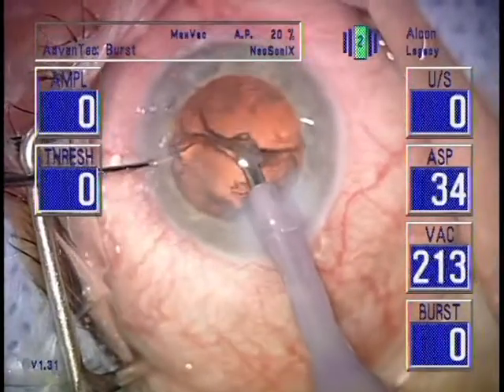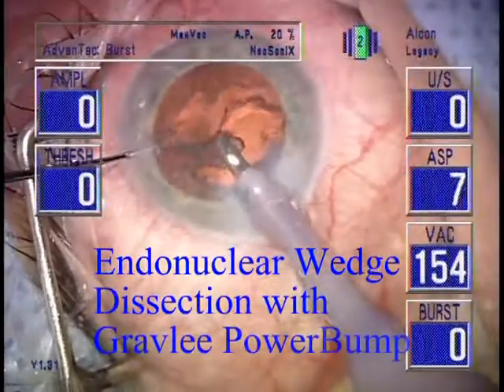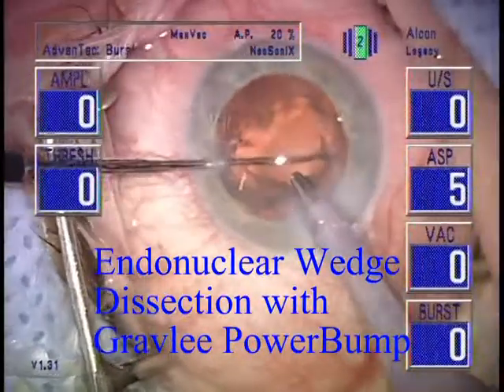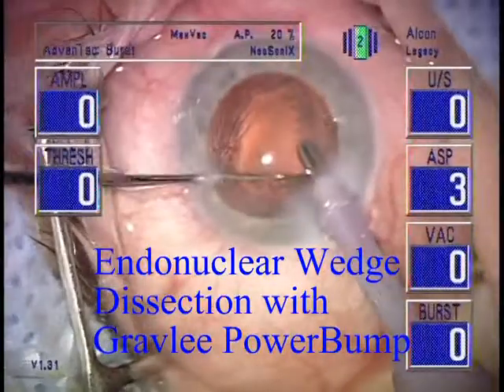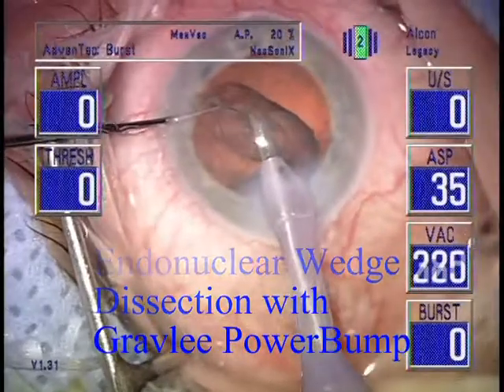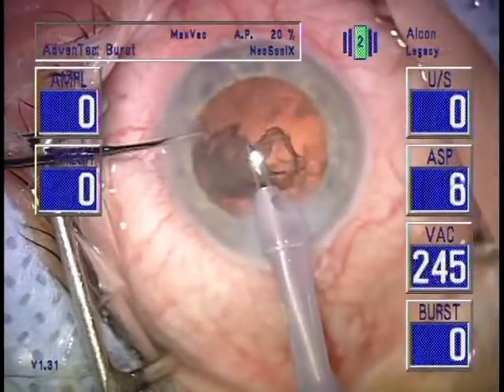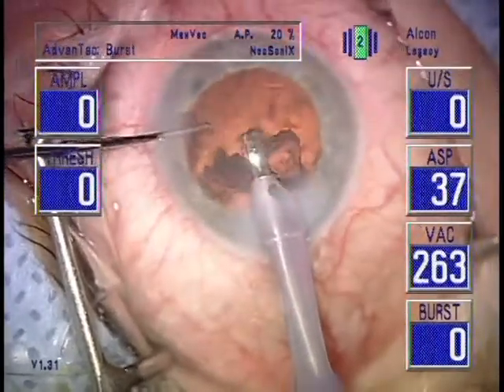There is low potential for collateral damage with corneal burns, corneal edema, glaucoma, iritis, or cystoid macular edema. The safest cataract surgery is delamination from the inside out: first removing the endonucleus using the natural rigidity of the epinucleus, and then the cortex, to prevent the posterior capsule from prolapsing or trampolining into the center of the eye.